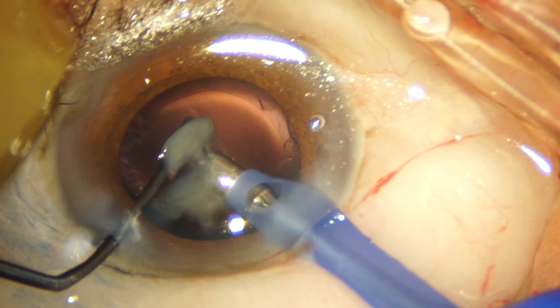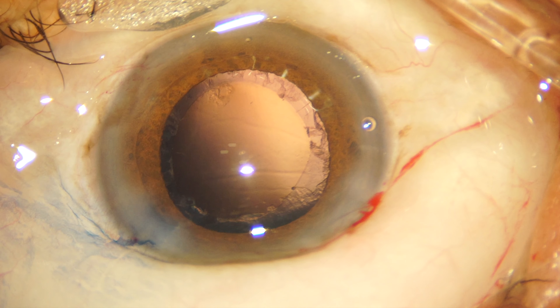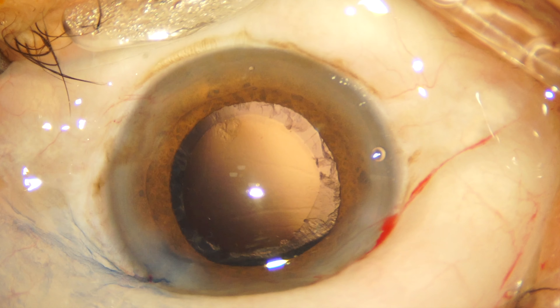Phacoemulsification goes ahead routinely and very little or no cortical fibers are present in the capsular bag.